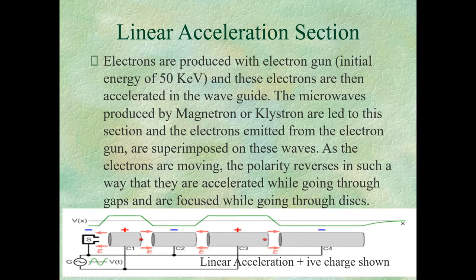So this peaked beam, if we have a small field, like if we are treating SBRT or SRS, gives us an advantage that we can increase the dose in the center of our field and reduce the dose in the peripheries. So in the peripheries, we may be protecting some critical organ. This reduced dose is helpful in protecting critical organs, and this increased dose in the center is helpful in hitting the tumor with the maximum dose.